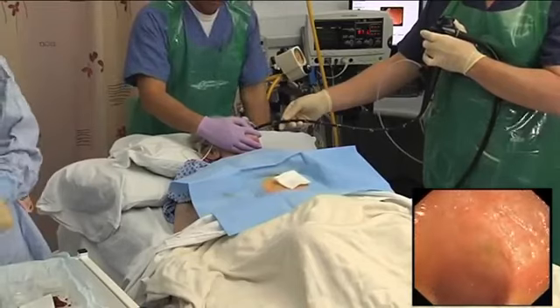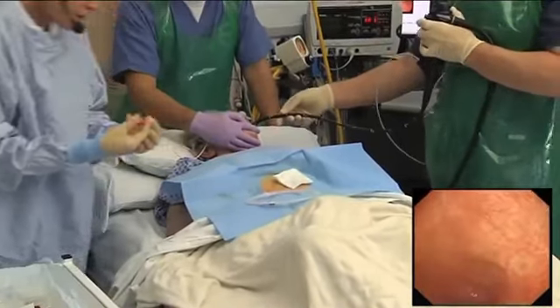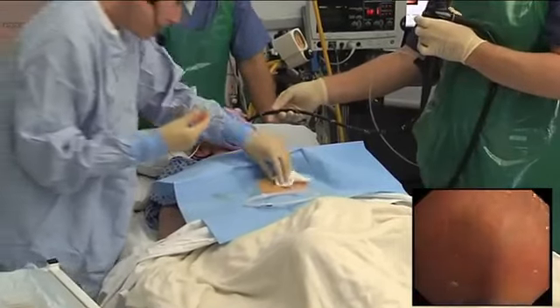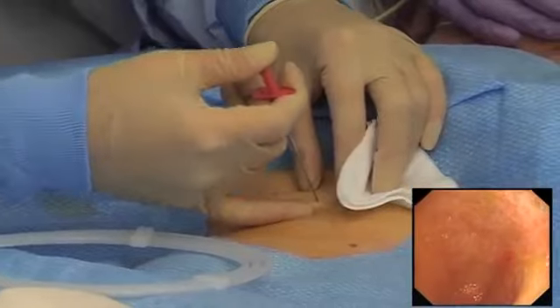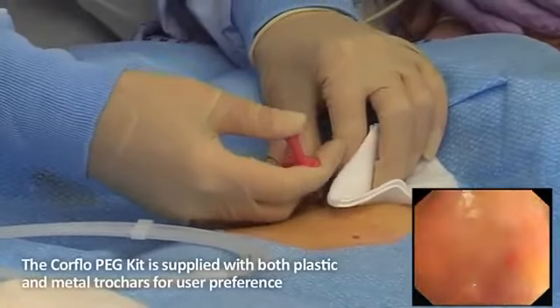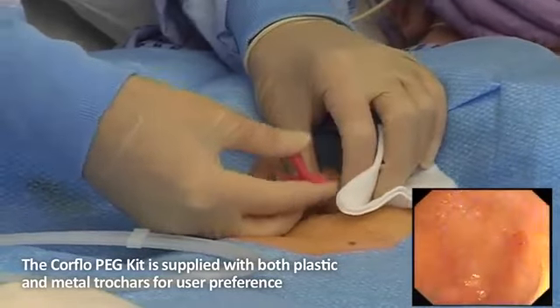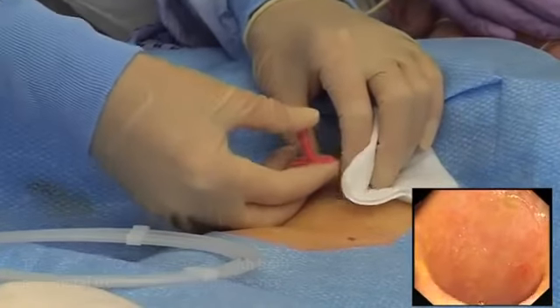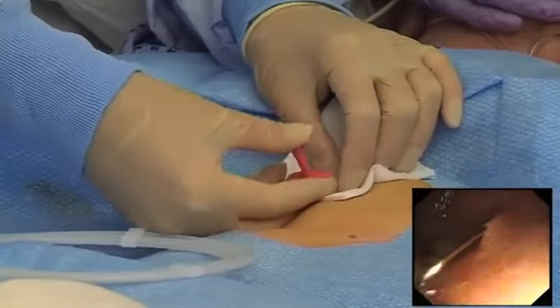And then we get our trocar needle, making sure it lines up, and your thumb on the end of it. I'm going to insert that in as I watch the screen, keeping plenty of air in so that the stomach remains up against the anterior abdominal wall. There we go. There it is, okay.